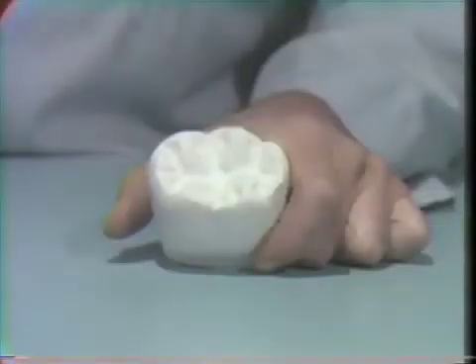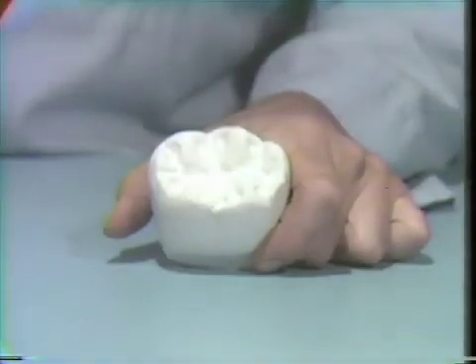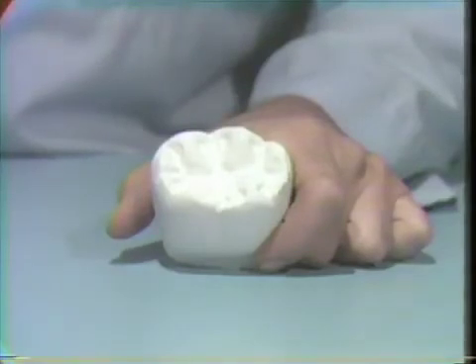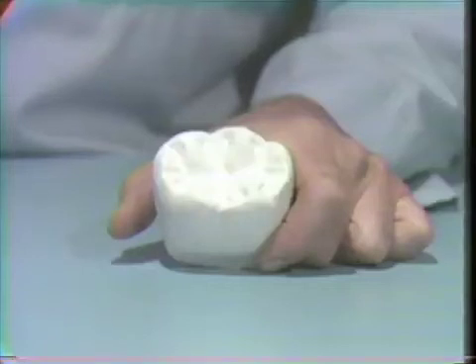Functionally generated occlusal registration generates a negative pattern of the opposing dentition. It follows logically then, rather than try to carve back the wax to match it, the wax should be built up to meet it. In order to do this, we must understand the component parts of occlusal anatomy of the tooth and the role that they play in function.